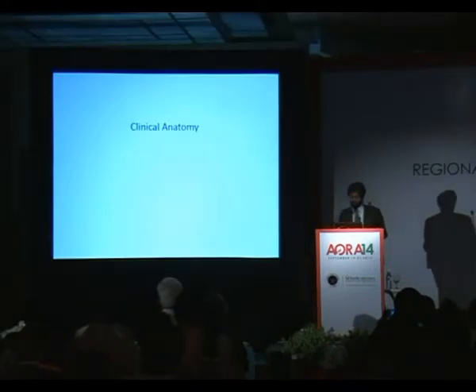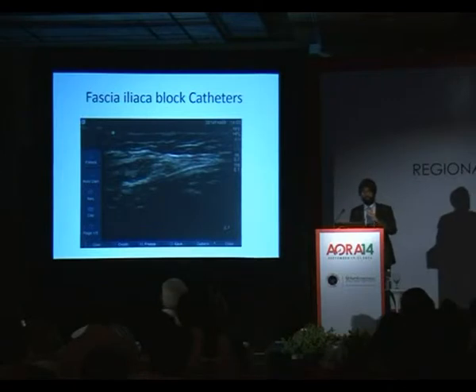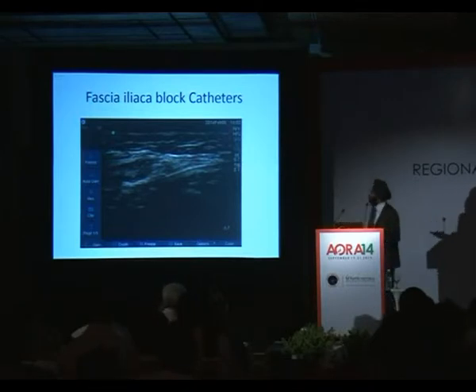Okay, coming next to the catheters. As we have seen from the needling technique, putting in a catheter should be very easy. If you don't have the specific regional anesthesia catheters, you can just put a Tuohy needle and guide the normal catheter that you would use for an epidural. Again, the end point or the goal should be to get the catheter tip towards the pelvic side of that hill.